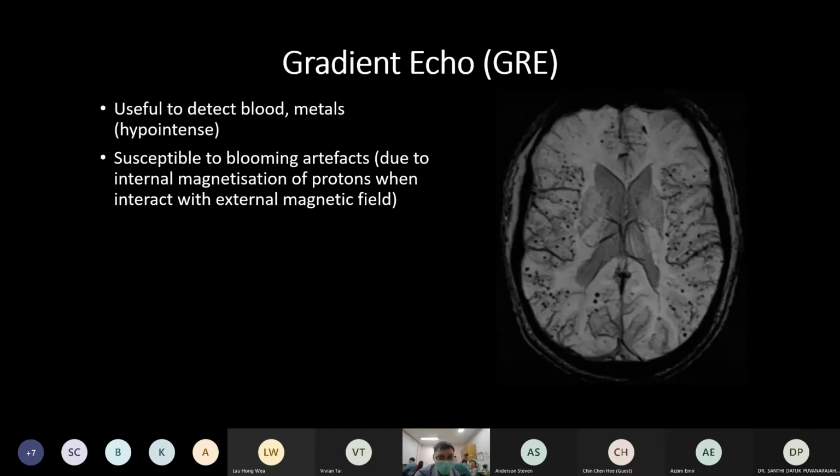And it's true enough. After further study, we know why it's severely dark, because, back to the basic principle that we learned before, MRI uses a magnetic field to align the atoms, and subsequently exerts radio frequency energy to make them in phase, make everything the same. Only then will the atoms release the energy back to the surroundings, or what we call relaxation.